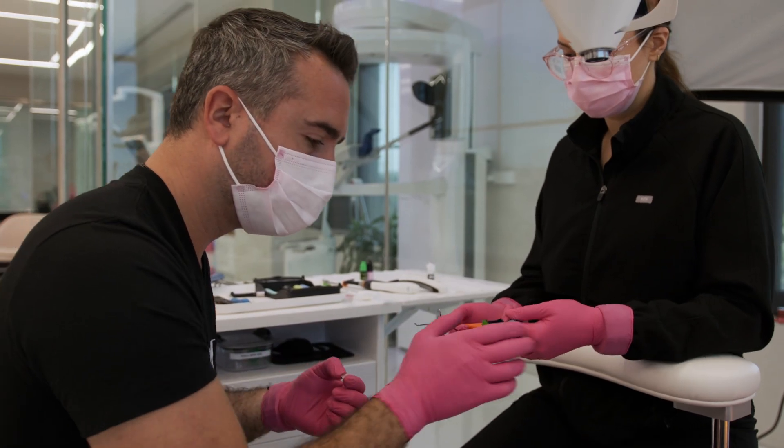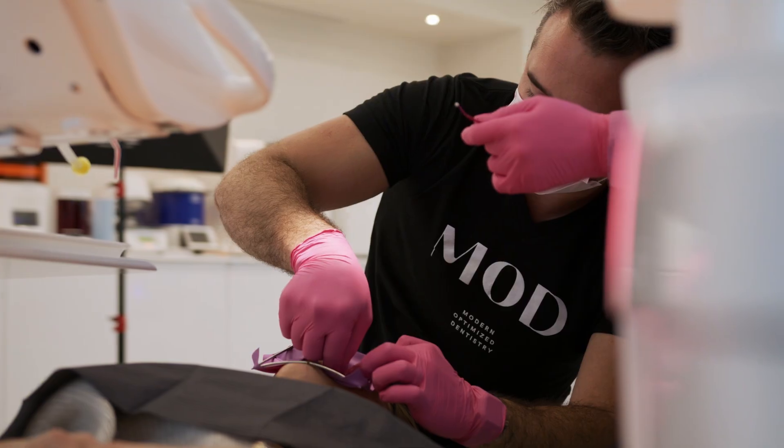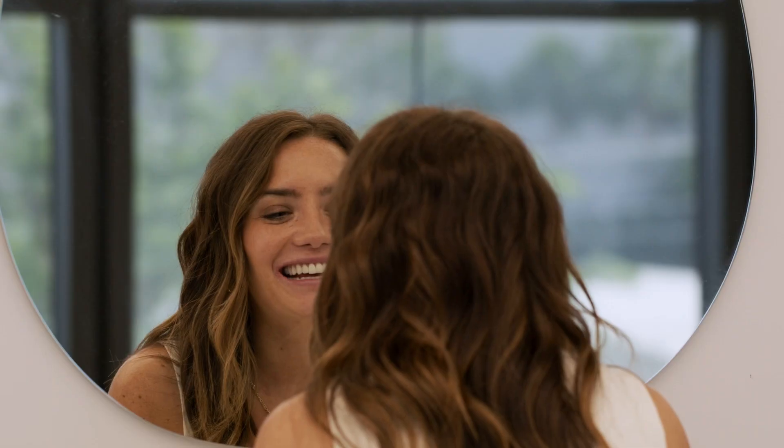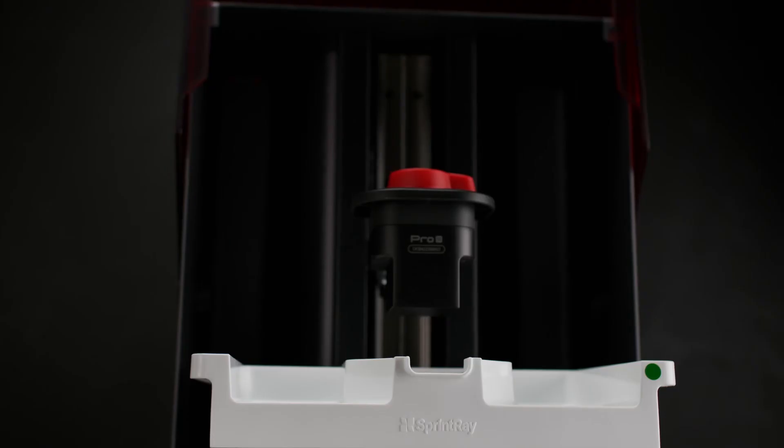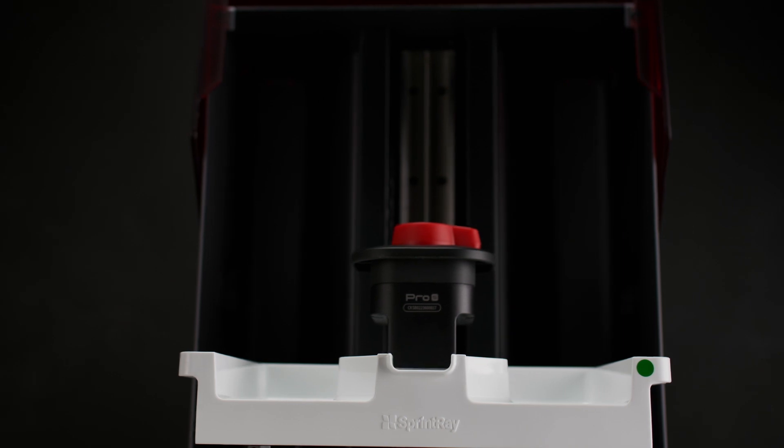With well over a thousand printed restorations bonded in place, I have seen firsthand how these restorations can fundamentally change the way that we deliver care for our patients. And that's why I'm excited to partner with SprintRay on this special course.